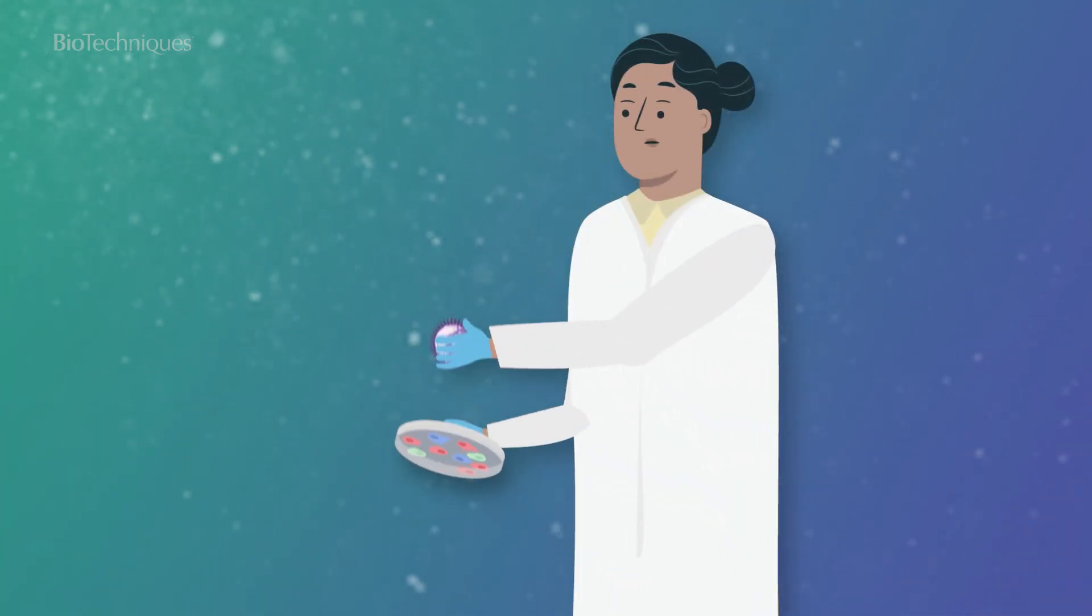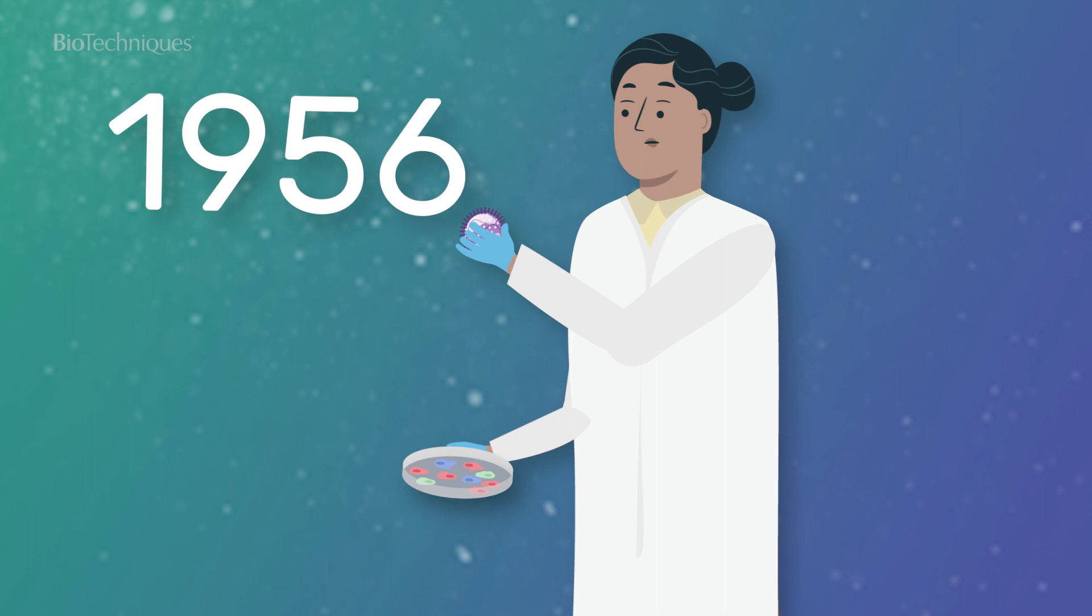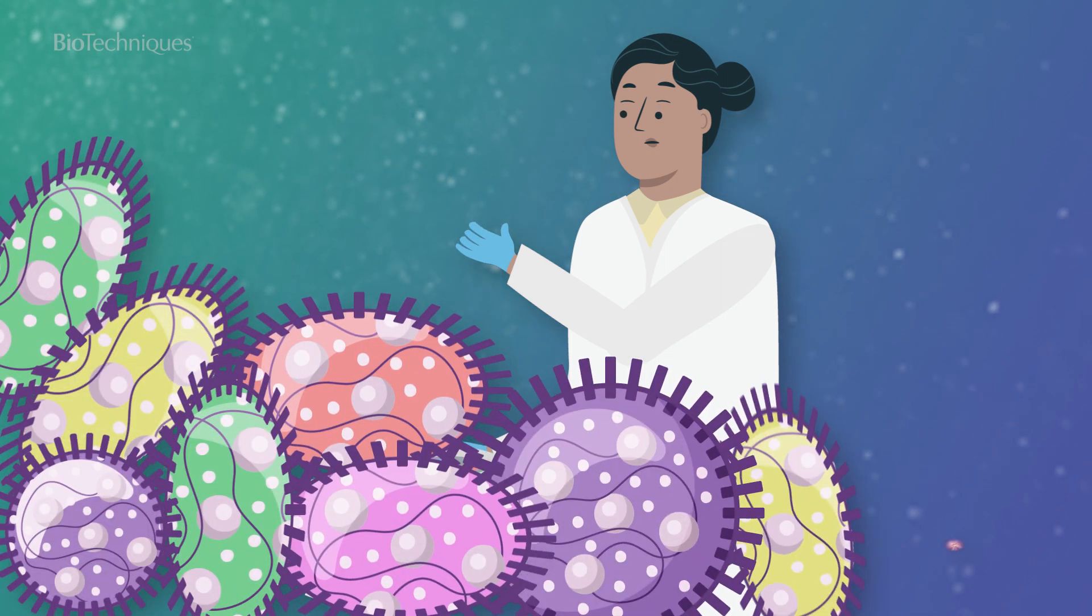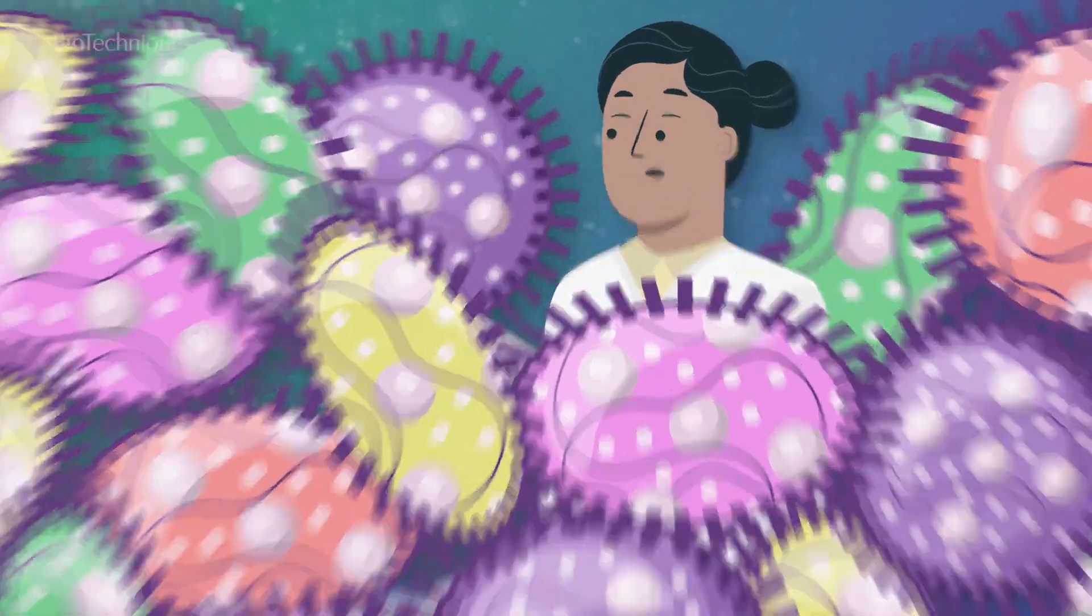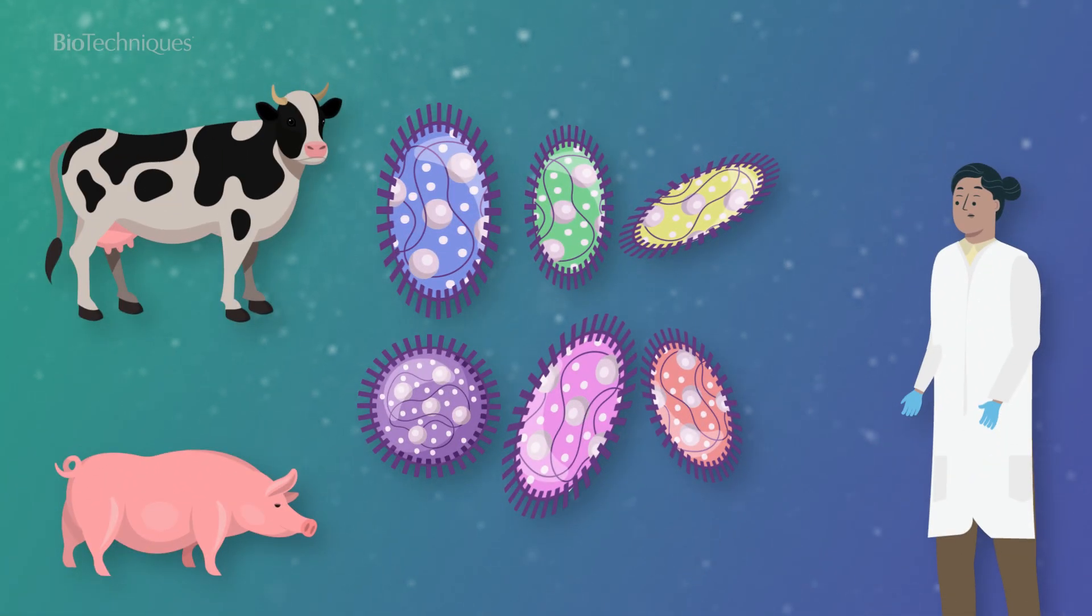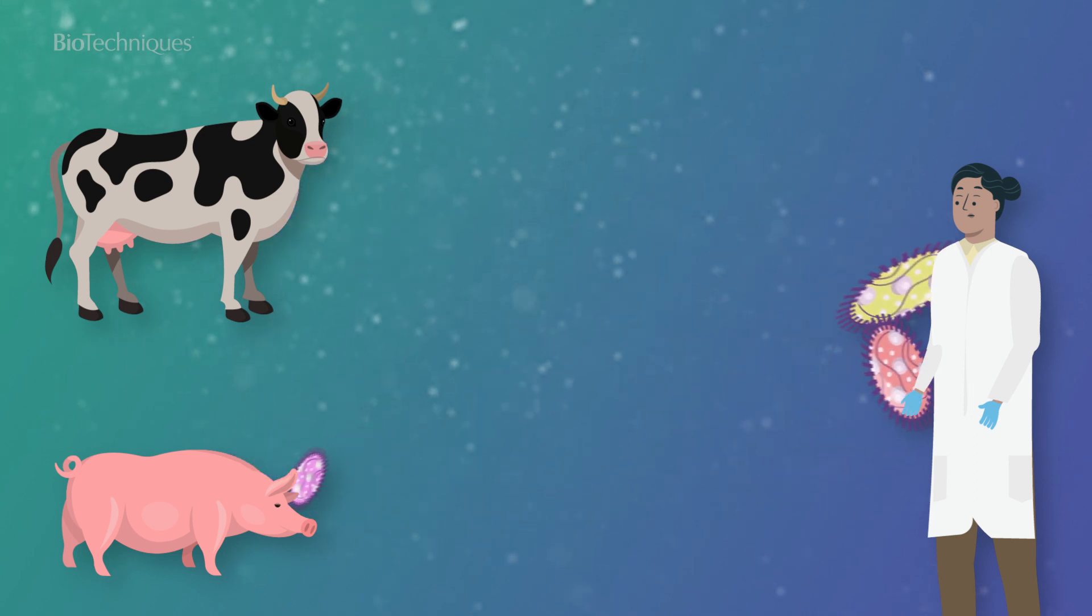Mycoplasmas were first isolated from cell cultures in 1956, and since then, over 180 mycoplasma species have been identified. However, 95% of cell culture contamination is due to just six species originating from human, bovine and swine.